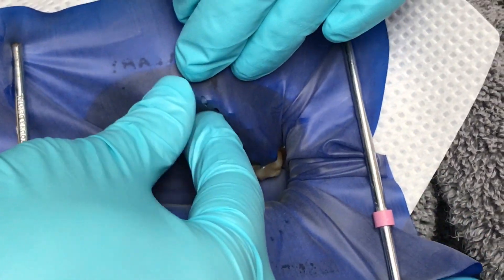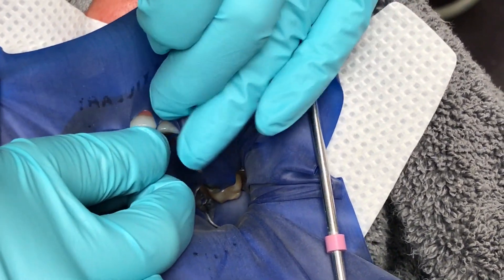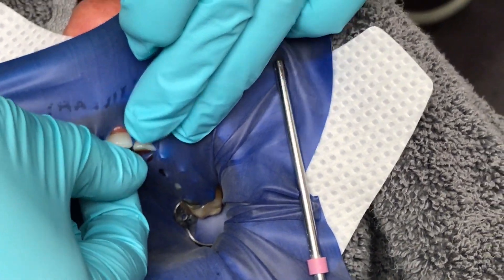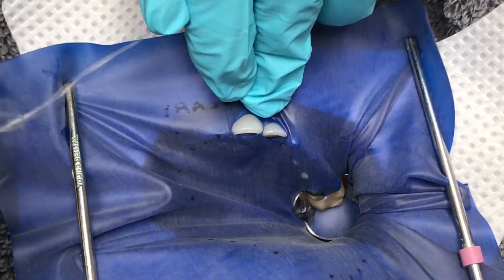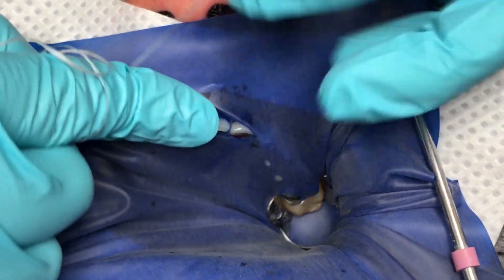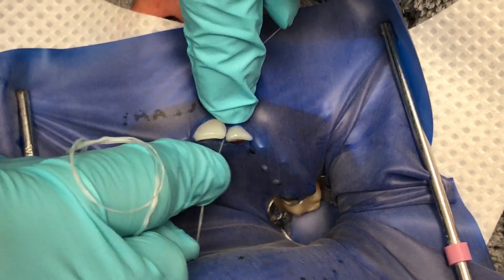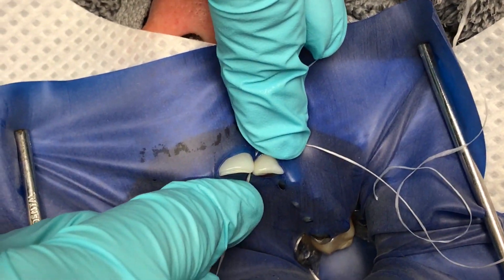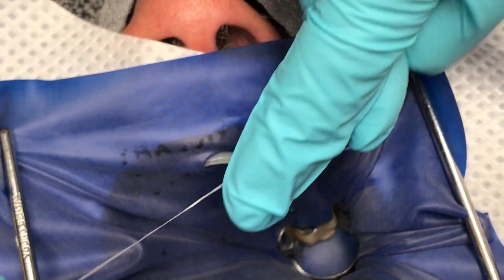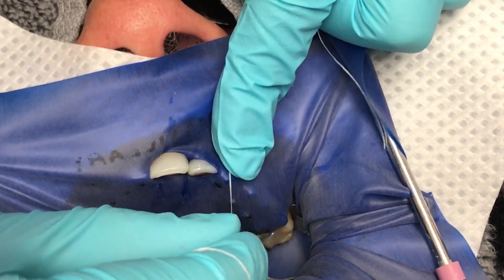With the foundation set, I can now start to floss each hole around the teeth. It is easiest to start with the midline tooth — in this case, number 9 (the 2-1). I begin by pulling open the hole to start and fitting it around the tooth and the lateral as well. Then with my floss, I begin to floss the dam down around the tooth. It is easy to rip a dental dam, so it is important to remember that you are pulling the dam down by flossing between the tooth and the dam. The biggest mistake people make is trying to force the dam down by flossing directly on the rubber dam — if you do that, you will end up with a tear.